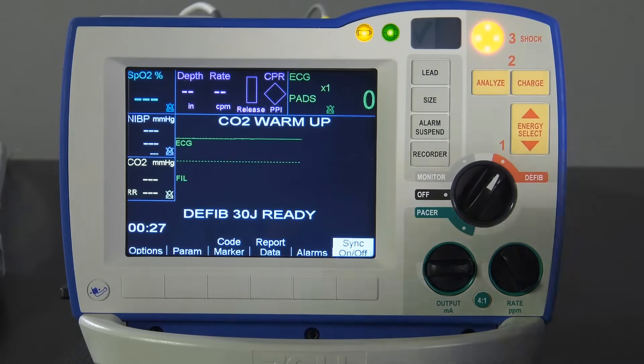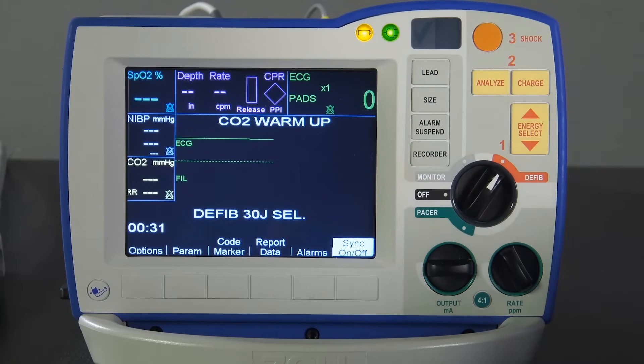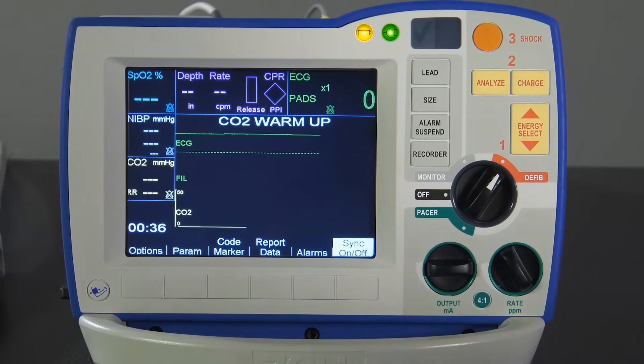Press Shock. The display should indicate Test OK. If this message does not show, notify Clinical Engineering. Check your institution's policy to confirm manual testing frequency.